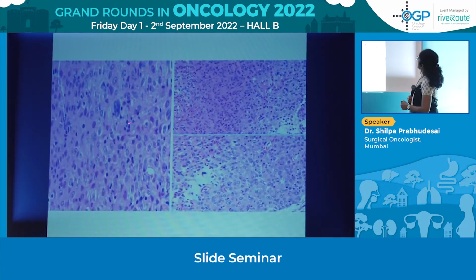Here I would like you to appreciate that these cells have this nice nuclear membrane, very neatly as if drawn by pencil, and there is this single conspicuous nucleolus that one is seeing. It is appreciated everywhere, again these small lymphocytes. So there's really only one diagnosis over here. The site is a little unusual, it is in the bone. So would anyone want to venture what this is?